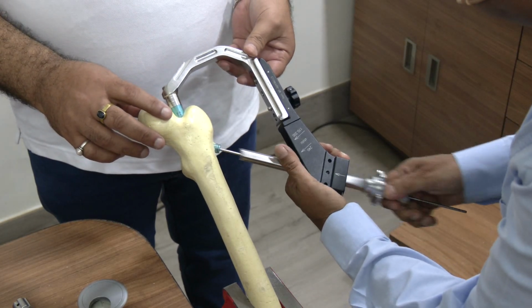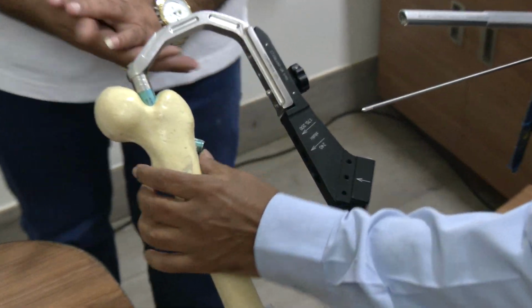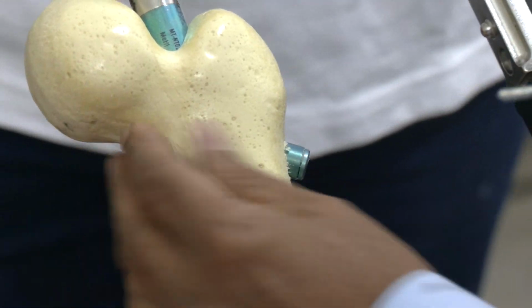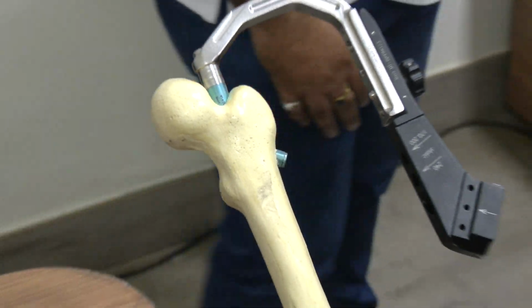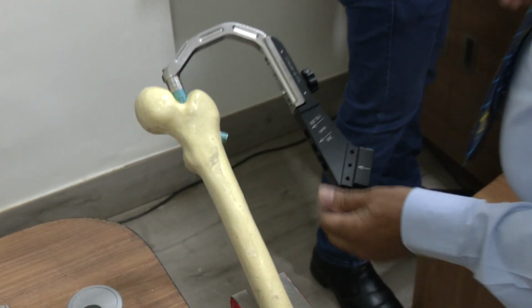Now I'll take out the jig and the guide wire. So you can see that it's sitting quite well. Since it's a hard bone, we have not drilled properly. It's slightly out. Otherwise, it was flush with the bone. It sits without any problem. Now, to do a distal locking, we can do a static locking.